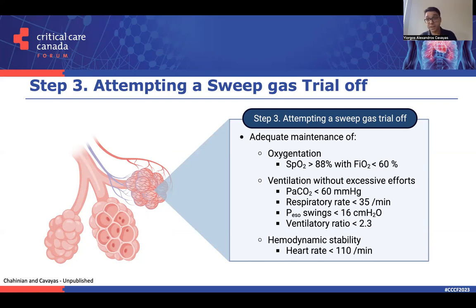If the patient develops signs of failure, it is considered a failed liberation attempt. If the patient does not develop signs of failure after some period of observation, then the trial is considered successful, and the patient can be safely decannulated.